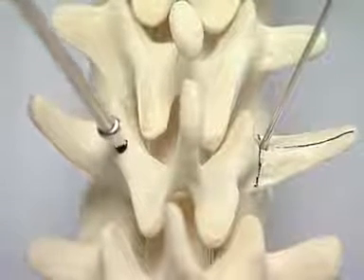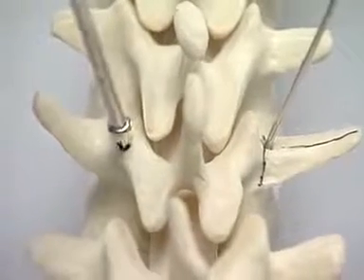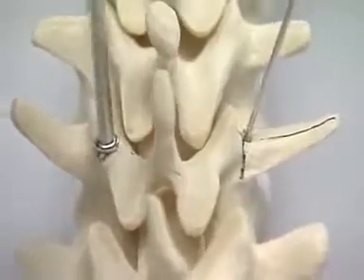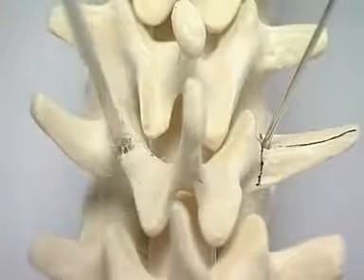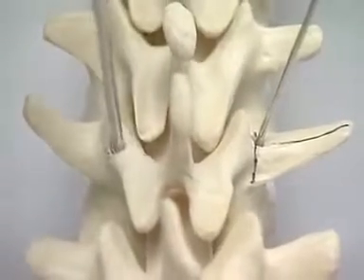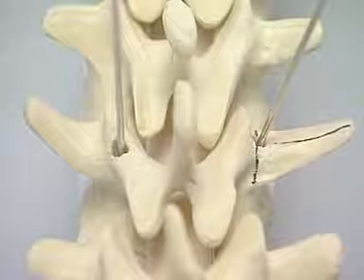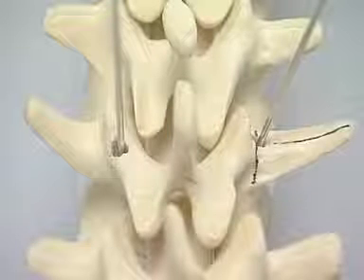Use the pedicle awl to open the posterior cortex through the more medial entry point. In vivo, a rongeur may be required to remove the base of the articular process. The pedicle probe is now used to drill through to the anterior cortex. A K-wire is inserted. It can be seen that there is less angulation towards the midline with the medial entry point.